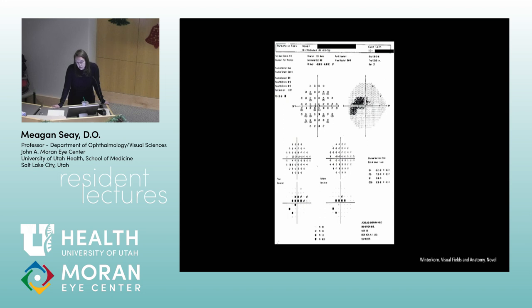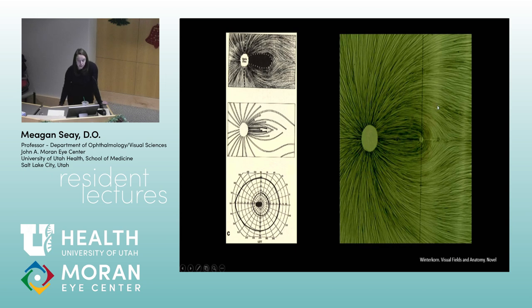So we don't know anything about the right eye, but it could be normal, it could also be like this. So you're thinking correctly along the lines of optic neuropathy, and potentially glaucoma could look like this. So that's all good. And then cecocentral scotoma is affecting this papillomacular bundle in here. And this area in particular is very sensitive to oxidative stress, so things like metabolic deficiencies or medications like ethambutol is one to think of can cause significant stress to this area and cause a cecocentral scotoma.